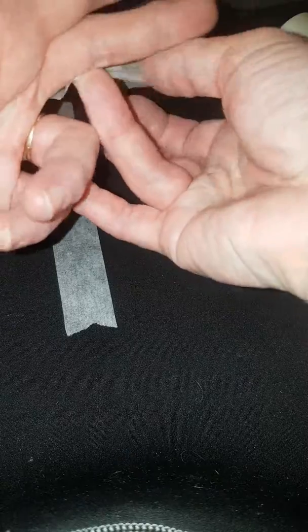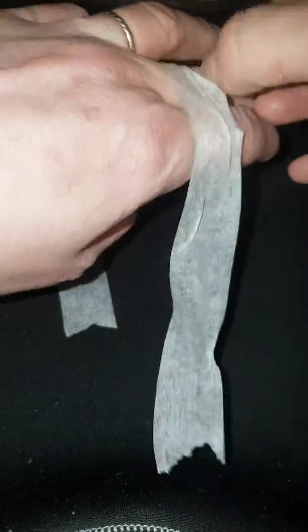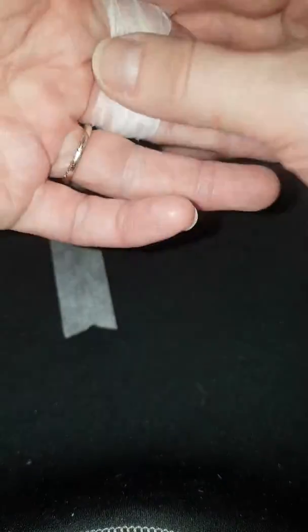So you take the tape and start it off on the uninjured finger — just put a little bit on the side, and then it comes round and goes over the top. You start it at the bottom like that, and then when you come over the top with no creases in it, it won't be circumferential on either of the fingers because there's a gap on each side.